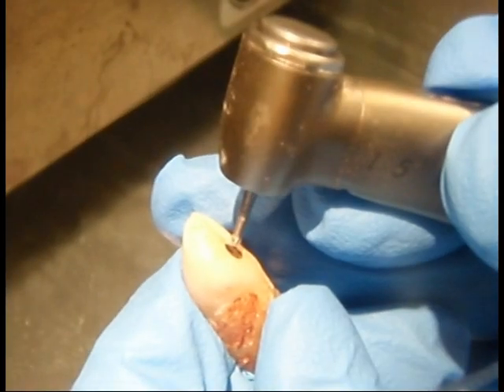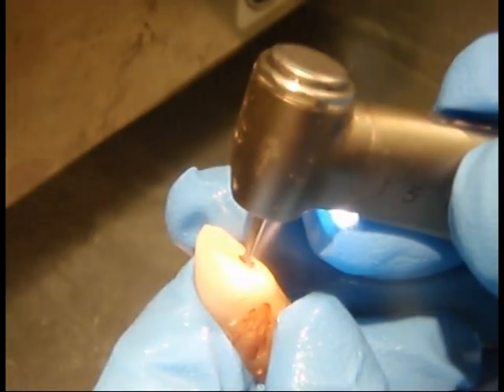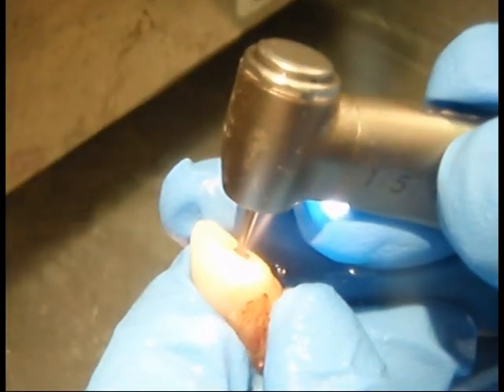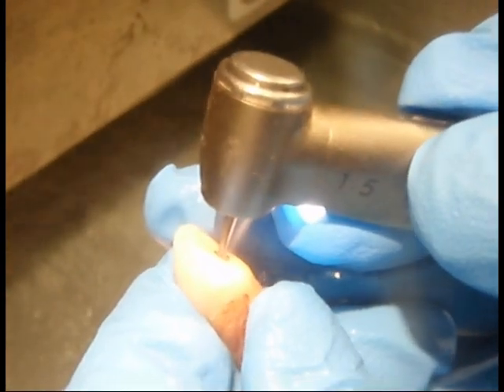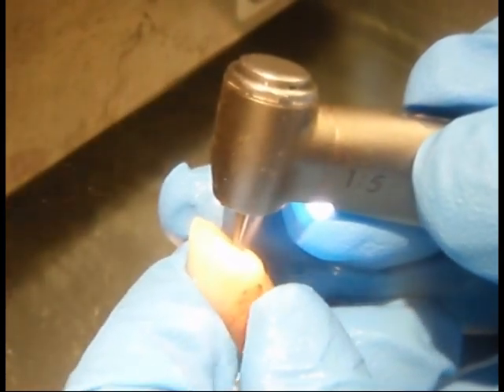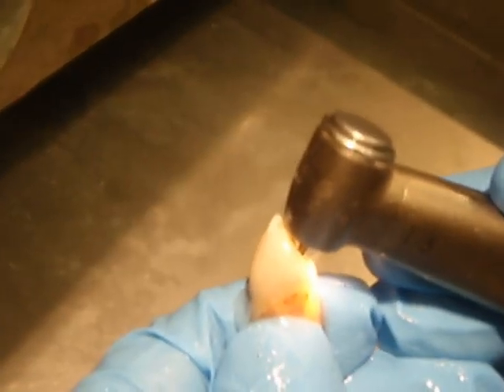With a better understanding of this particular tooth's structure, we will unroof the pulp chamber by cutting an oval access on the tooth's lingual surface with a number two endo-access round burr. The physical dropping of the burr into the chamber will be tactilely felt.